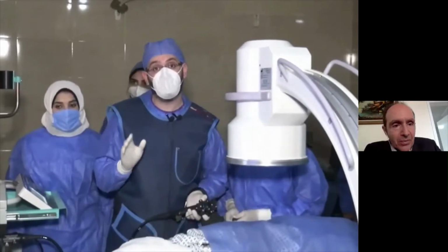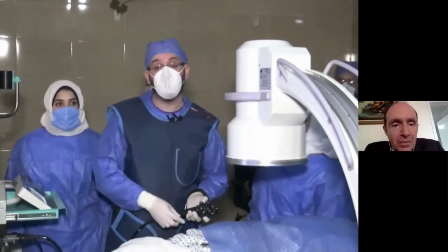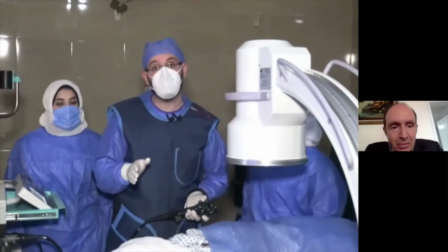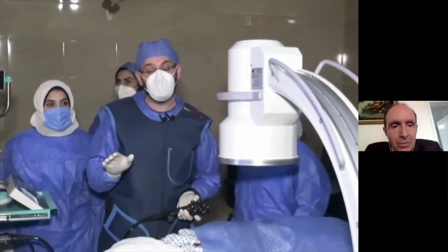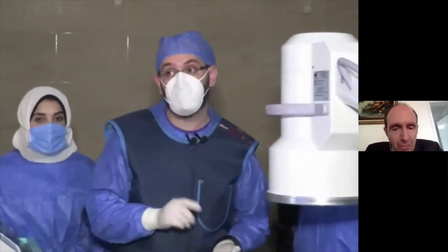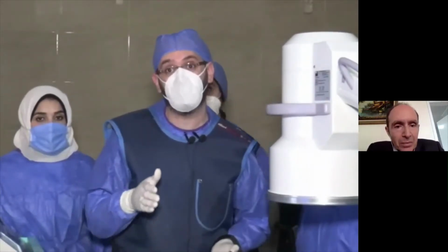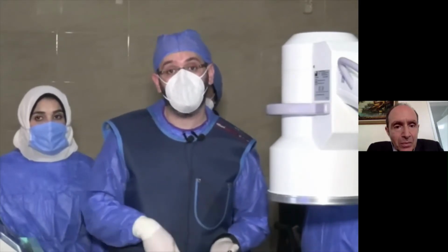The tumor is invading into the liver and invading the porta hepatis with total encasement of the hepatic artery. The patient has obstructive jaundice. A trial of ERCP, despite cannulation, failed to pass the stricture, not visualized even by injection of dye, with total complete obstruction and failure to pass into the common hepatic duct into the liver. So we have the last combo case. We are going to do EUS guided biliary drainage. We are going to take a biopsy using FNB from the mass itself.